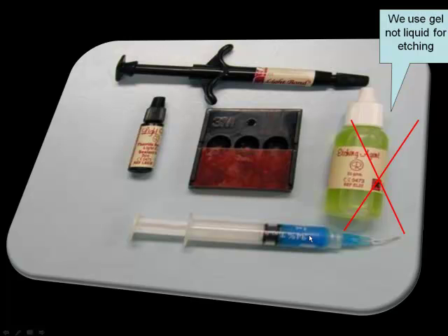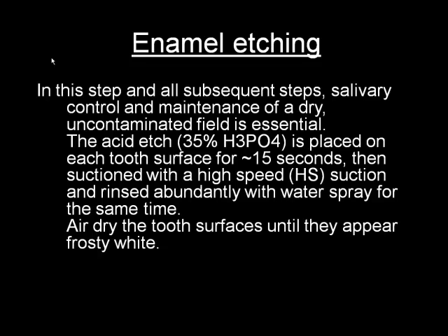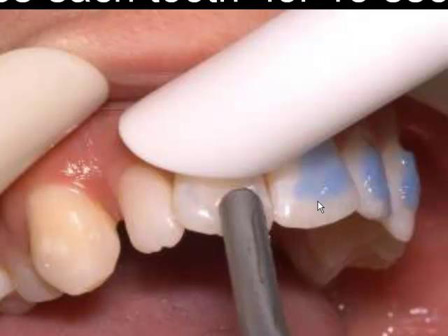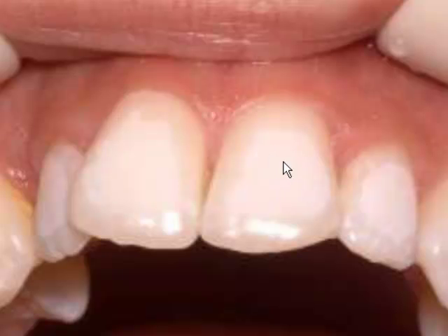First of all, very important: isolate your teeth with cheek retractors like so, and make sure the patient is fairly comfortable. Then you etch with 35% acid for 15 seconds and remove the excess with water. The advantage of using the gel is that you can position it pretty much where you want the bracket to be, avoiding the mesial or distal embrasures and the gingiva. You rinse for 15 seconds with high-volume suction and air-water syringe, dry the field, and you have to see a chalky white appearance.